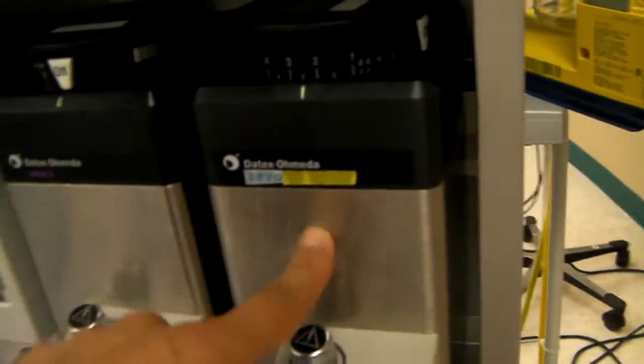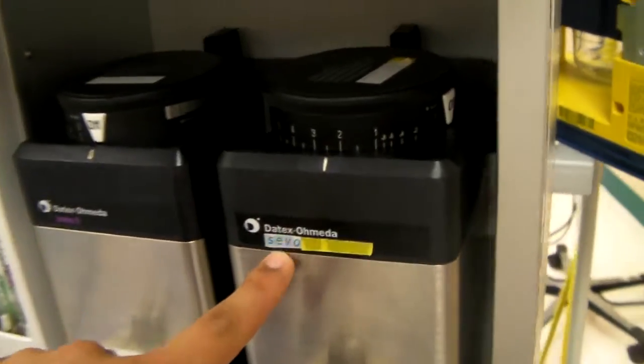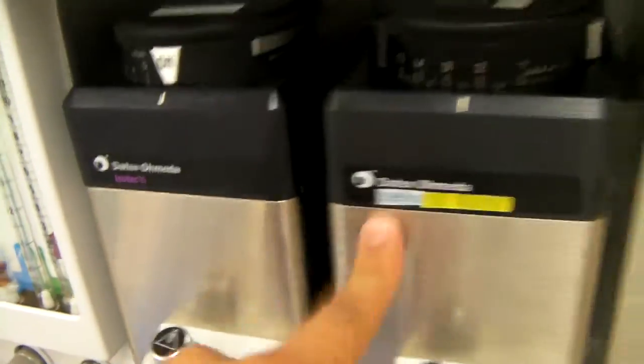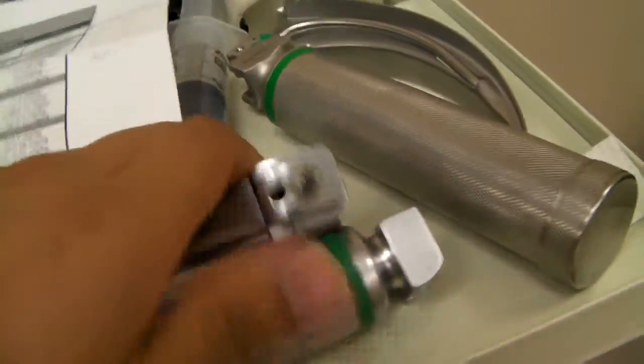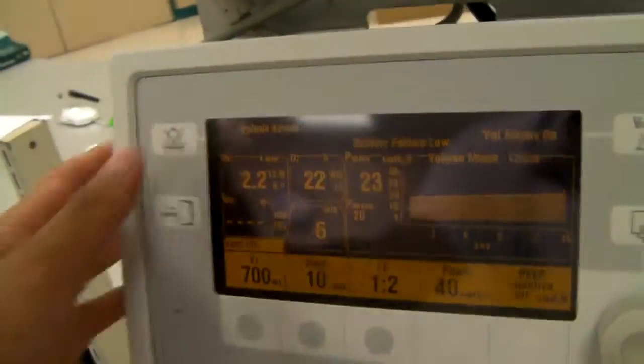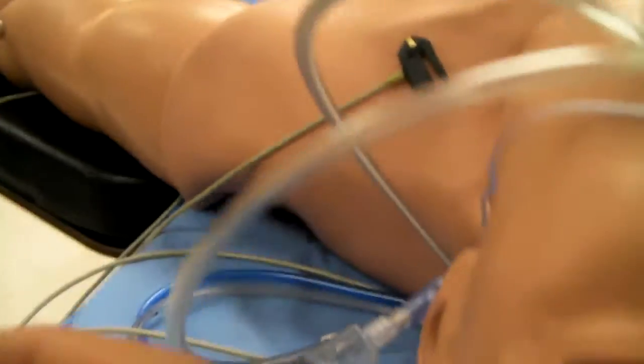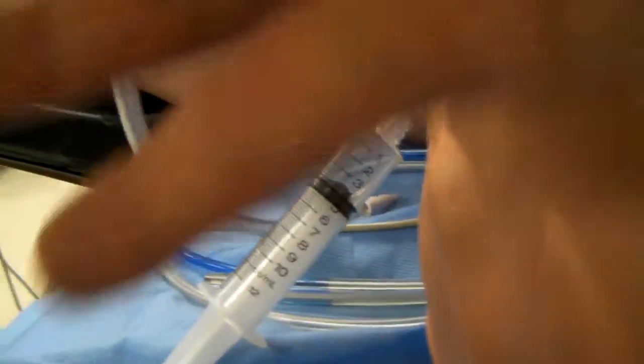Right now he's on an inhalational anesthetic, sevoflurane. There's also isoflurane, but I chose this one. There's just a lot of stuff that you can practice. This is a laryngoscope here. Okay, the alarm's going off. This is what you use to intubate the patient, basically. Okay, shut up, alarm. I'm trying to do something.